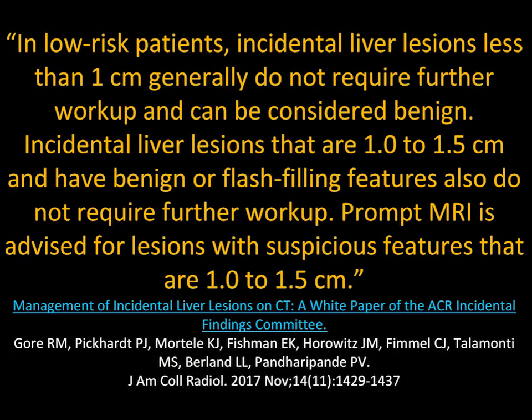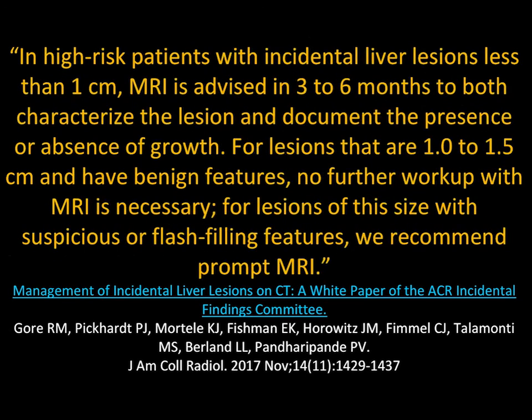And so they made some points. In low-risk patients, incidental liver lesions under a centimeter do not require further workup. Incidental lesions of 1 to 1.5 centimeters having benign characteristics, leave them alone. If it's over 1.5, or 1 to 1.5 but suspicious, do an MR for clarification. In high-risk patients with incidental liver lesions under a centimeter, depending on the situation, careful CT follow-up or MR would be necessary. But again, can you determine what the lesion is?